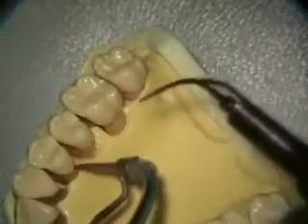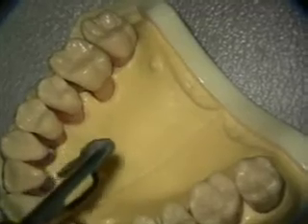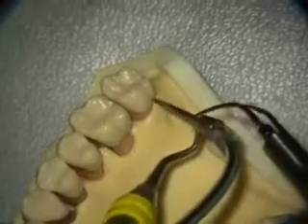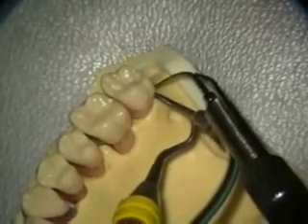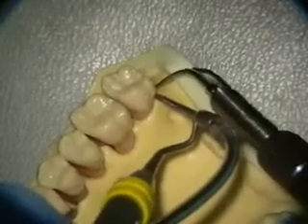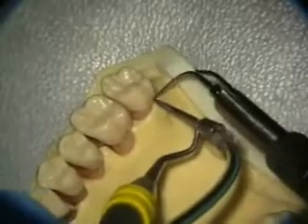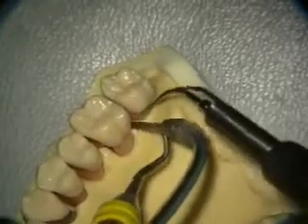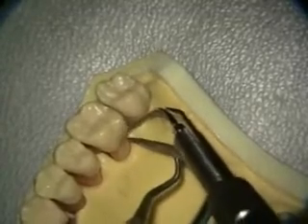Distal aspects of posterior sextants and the palatal or lingual aspects, wherever you can best fit them based upon where you're sitting and where the patient is. However, we'll get into the distal here by looking in there, placing it in, looking at the ultrasonic, and then looking at the screen and starting to move around so you can start seeing some sort of action. Watching yourself clean here, clean all the way to the distal lingual line angle, so you retrace your corner here. Then go into the palatal here, from the palatal on the distal here, clean.